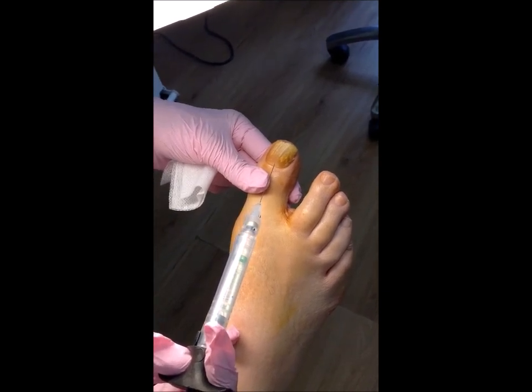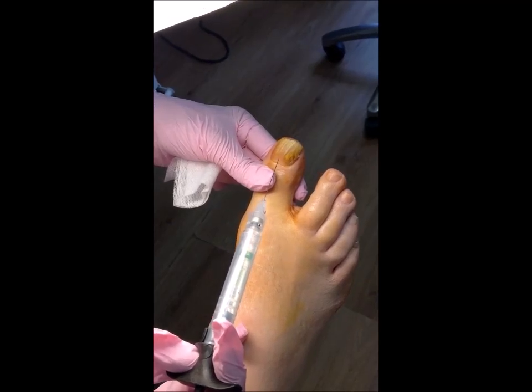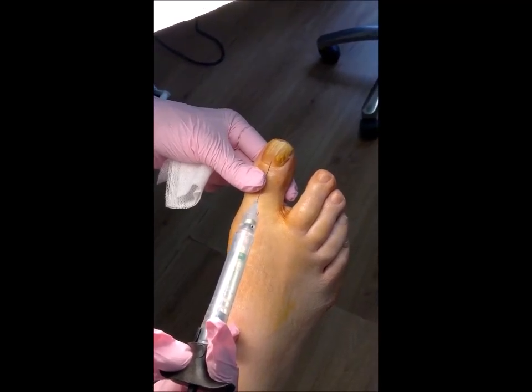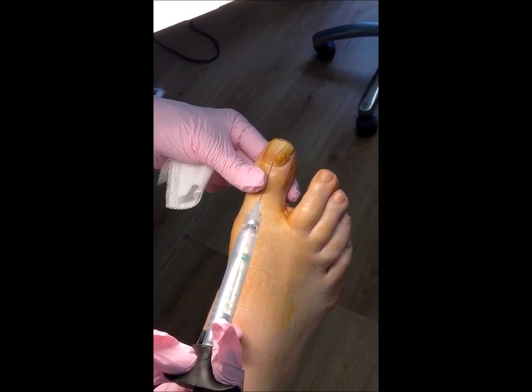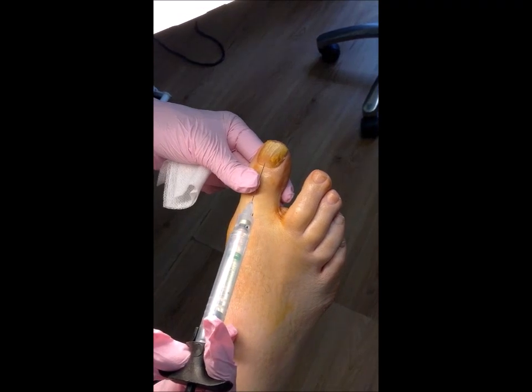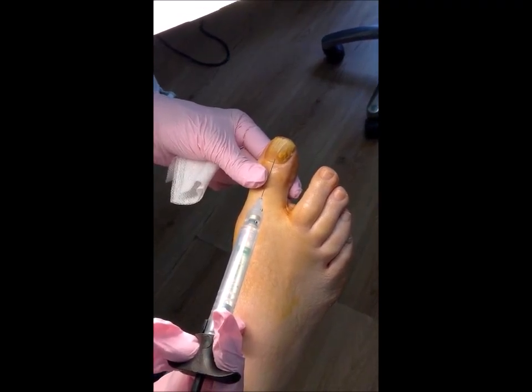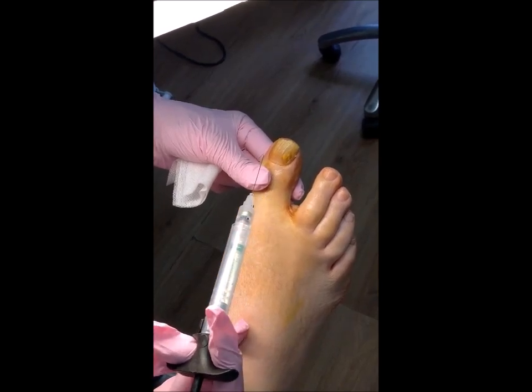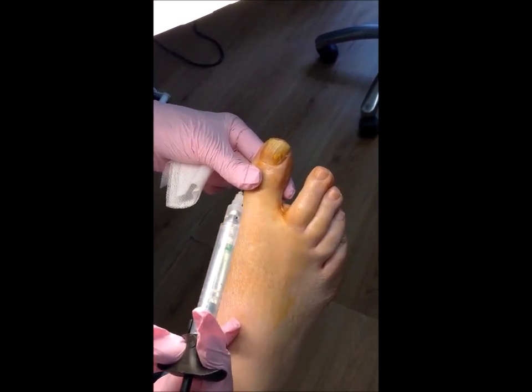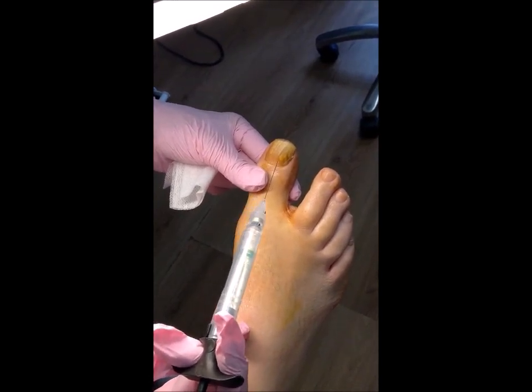Conservatively with topicals, even Lunula laser can have a problem with this because it potentially could have a biofilm in it, and a biofilm will be trapping dormant spores which at some point will come alive and start propagating, resulting in new colonization. So we really need to get this nail off, and then with a laser we can treat the nail bed of any infection, clear trapped spores, and get a healthier result.